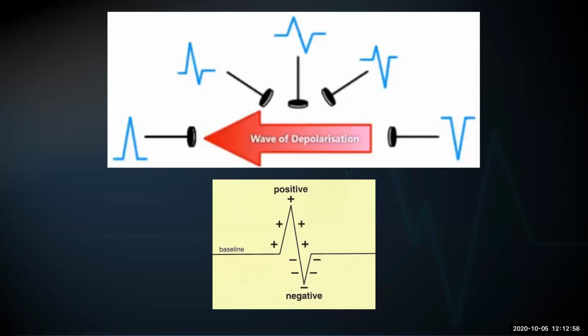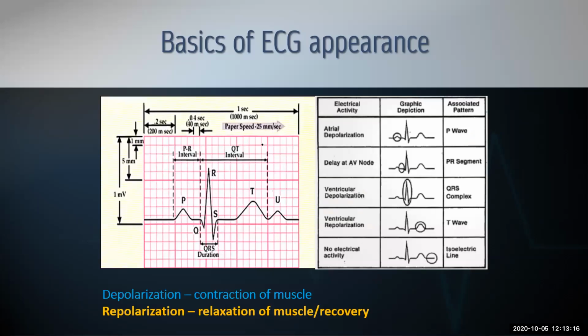And why do we think that's happening? Is it because there is LVH happening, so it's attracting more of that positive activity? Is there an infarct that's caught? Maybe it's at a bundle branch that's requiring the electrical activity to go around a diseased area, creating not necessarily a purely positive, but more of an isoelectric. Again, those things we'll go over, but it'll help you understand it more.